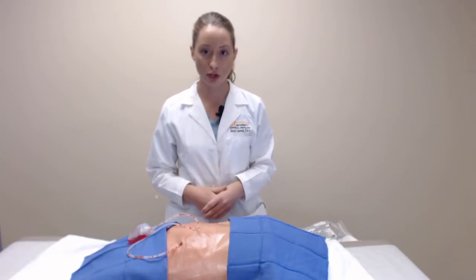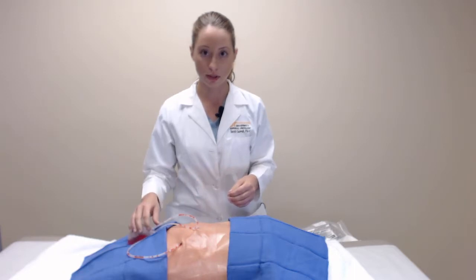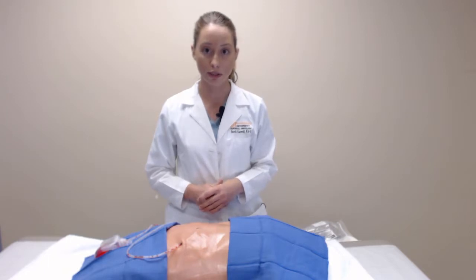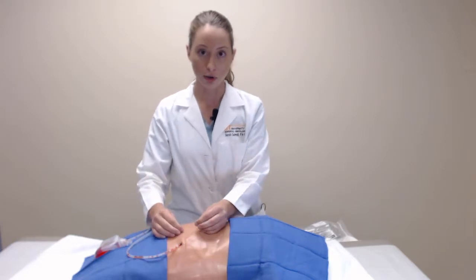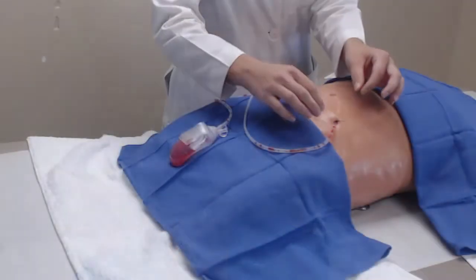However, for this demonstration, I'm going to do it without gloves so that it's easier for you to see the steps of the procedure. So to move on to stripping your drain, this process needs to be done 2 to 3 times a day depending on the recommendations from your surgeon. To strip your drains, you'll take whichever hand you're most comfortable with. Most people, it is with their non-dominant hand.